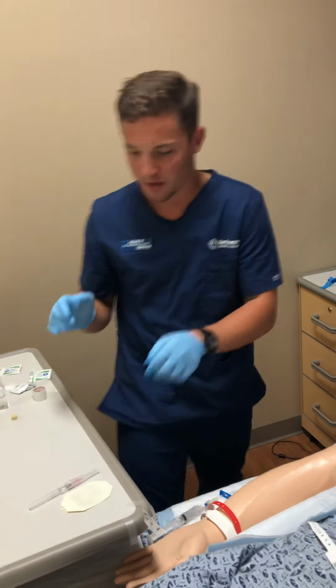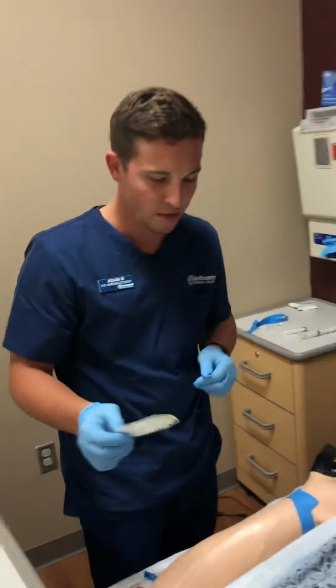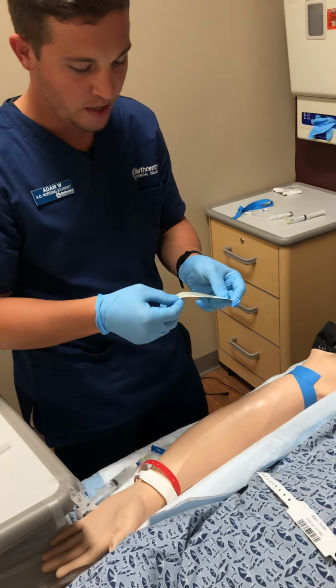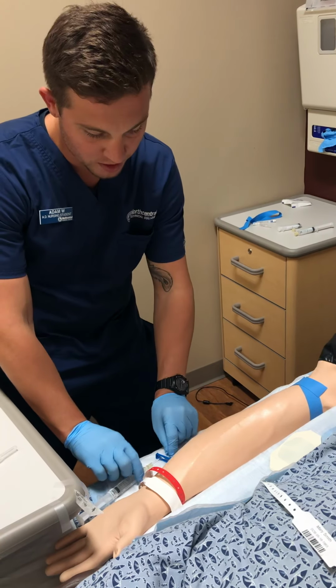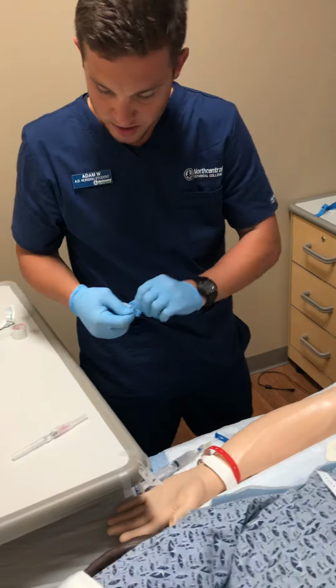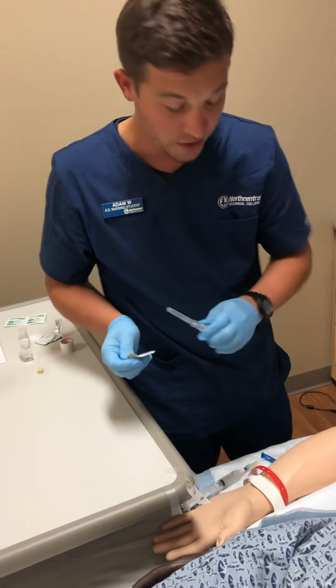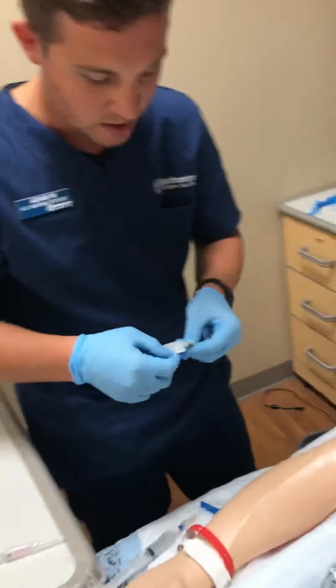Very good. Okay. I have a transparent dressing called a Tegaderm. I'm just going to set it in my area here, get it ready. Okay, I have my tubing here set up. I have another alcohol swab here, and I have my 20 gauge needle here, okay? So we'll just set this here.